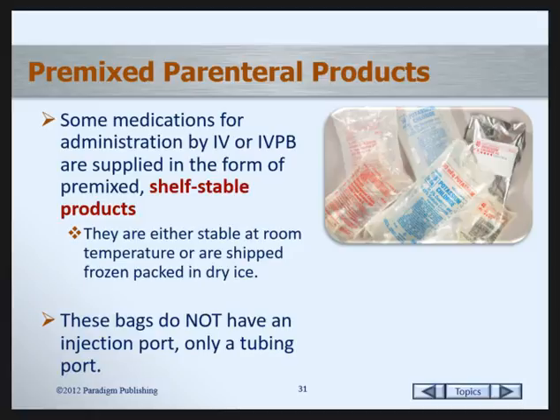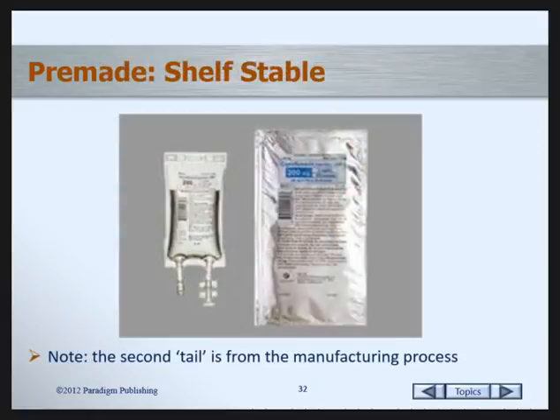These bags do not have an injection port, only a tubing port. You should never add anything into a pre-made bag. You would note, however, that sometimes it looks like they have a second tail. That tail is for the pumping process during the manufacturing of the bag.